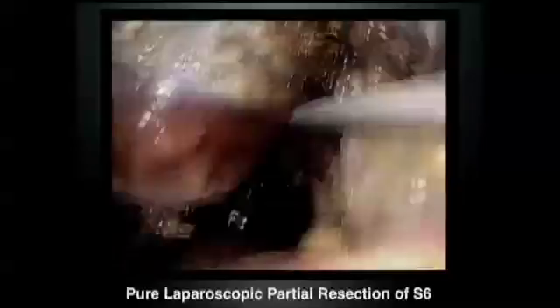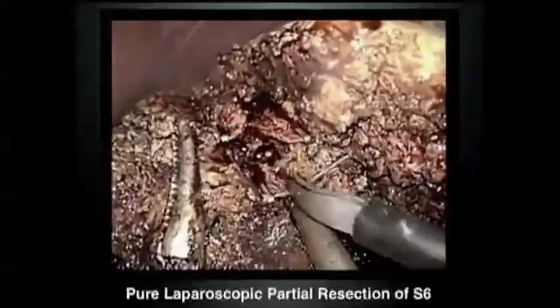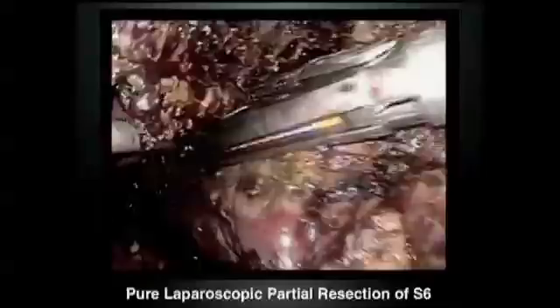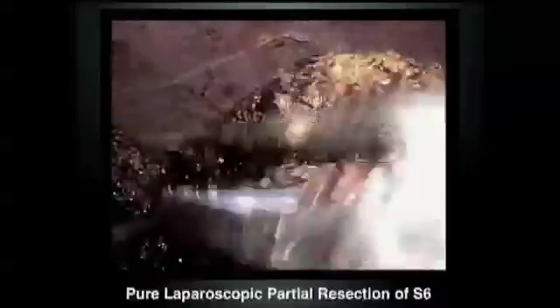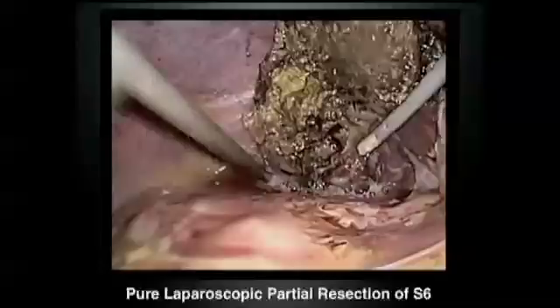This is also very important: after full mobilization of the right side of the liver, you can hang up the liver by placing these forceps. Precise identification of intrahepatic structures is also very important to reduce bleeding. Stapler can be applied for parenchyma transection, because this area has a lot of veins — the peripheral right hepatic vein and also Glisson's pedicle. The tumor has to be placed in a plastic bag and removed from a suprapubic incision.